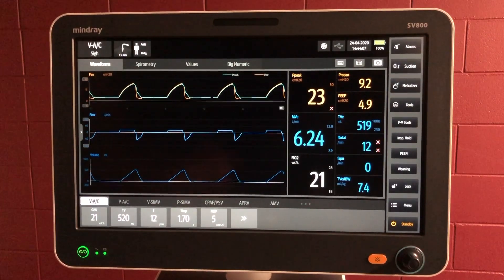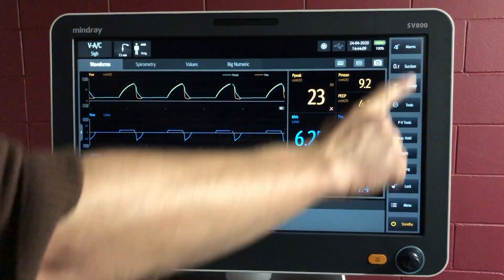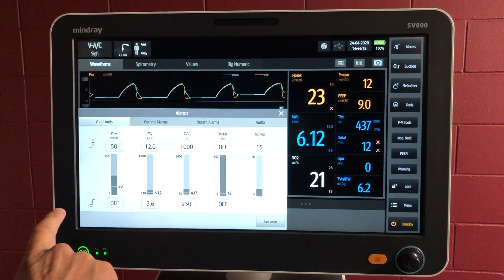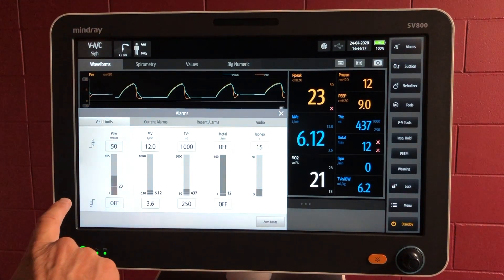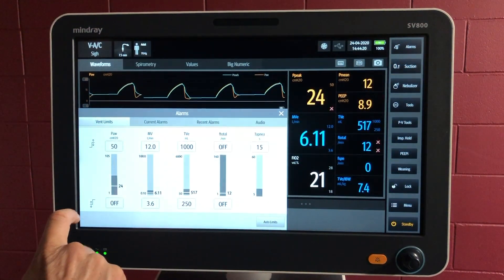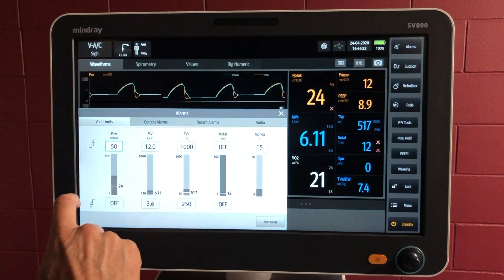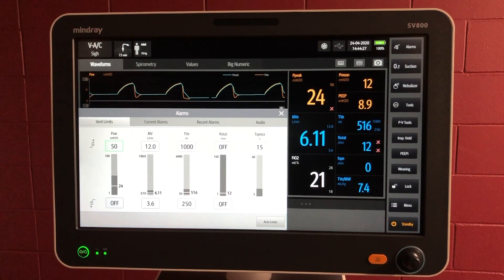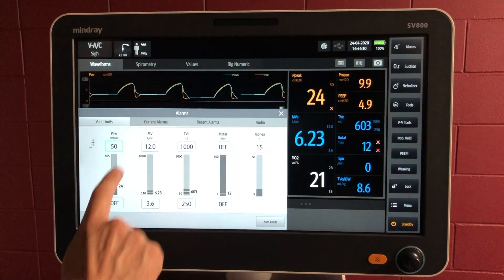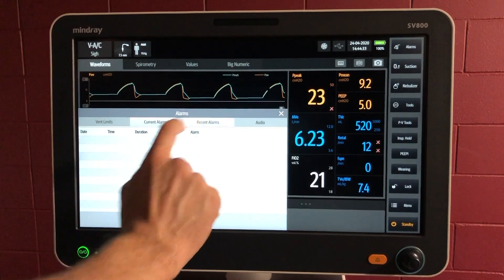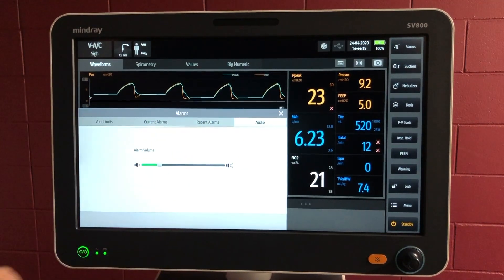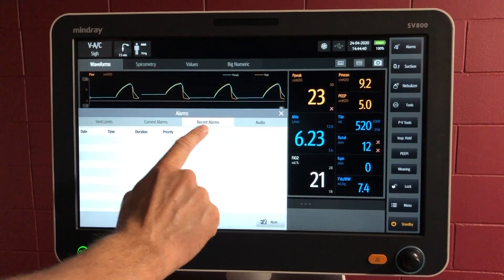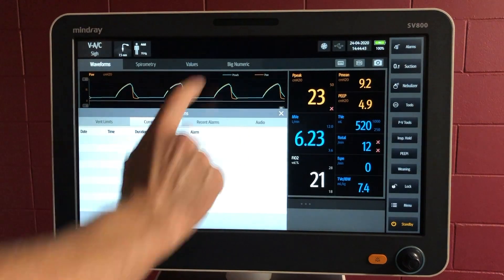Next up, we'll have a look at the right-hand side where we've got some control buttons. From the top, we've got alarms — you've seen this alarm screen already when it comes up with alarm messages, but that's how you electively find it here. When you push on those buttons and activate them, you can change them, just as we did before. These are the ventilation limits, and then any current alarms and recent alarms. And the audio as well, if you want to change the volume.